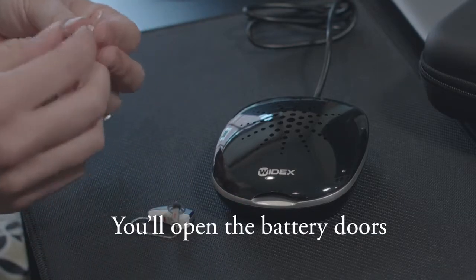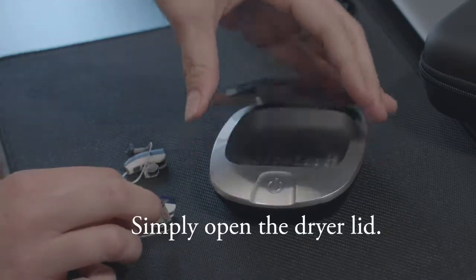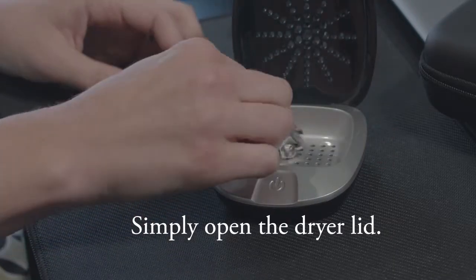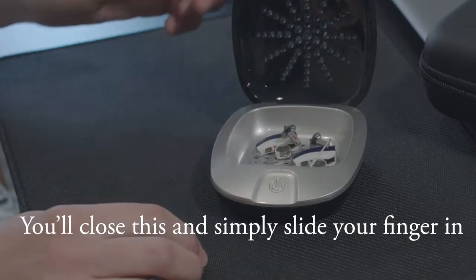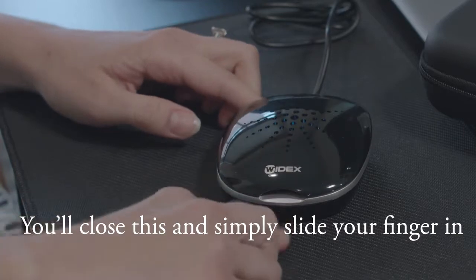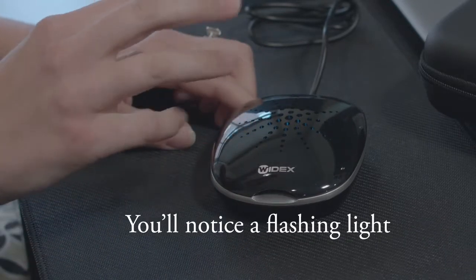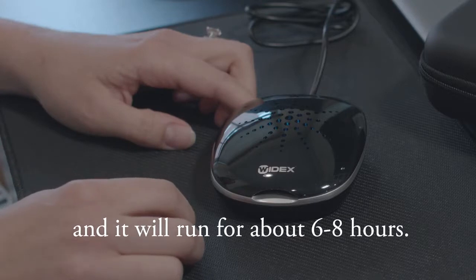You'll open the battery doors to turn the hearing aids off. Simply open the dryer lid — both hearing aids can be placed in. You'll close this and simply slide your finger in to turn the dryer on. You'll notice a flashing light and it will run for about six to eight hours.